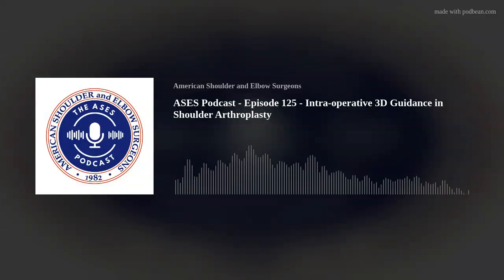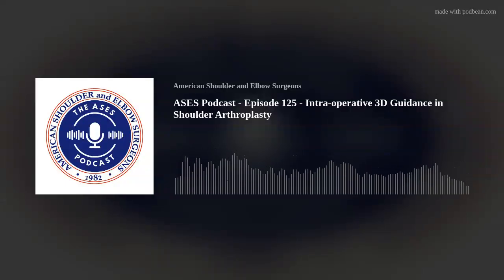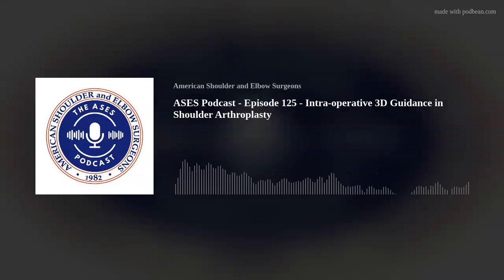Now, I love Brad's point about navigation. I think that's also true for robotics, in that it is flexible in the operating room to change things based on what you're seeing, and that's one of the limitations of PSI. You could have a great plan for your bony alignment. And I agree, and I wholeheartedly believe that the best way to get your soft tissues balanced is to get your bony alignment correct. But at the end of the day, shoulder arthroplasty, whether it's anatomic or reverse, is still a soft tissue balancing procedure. So you have to be able to adapt that plan in certain cases in the operating room to adjust to what you're seeing. PSI doesn't really give you that flexibility.